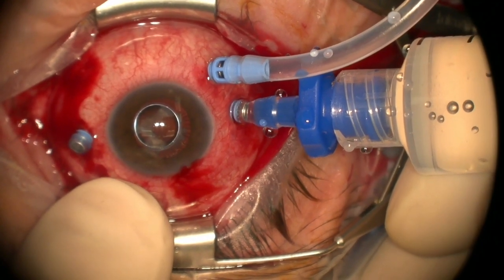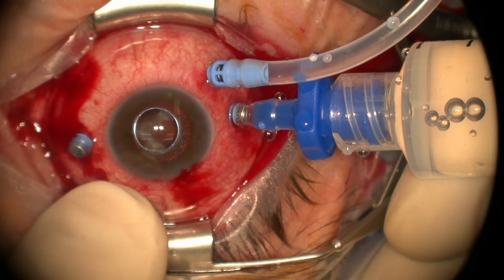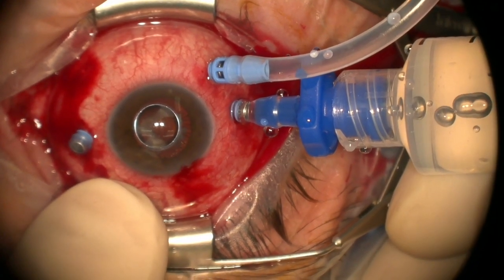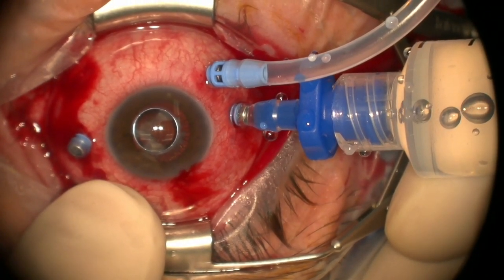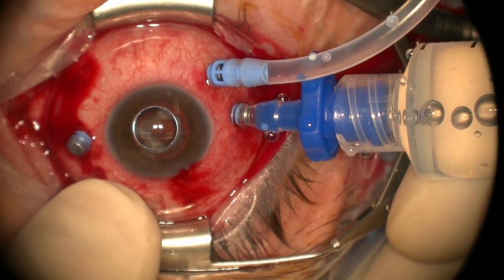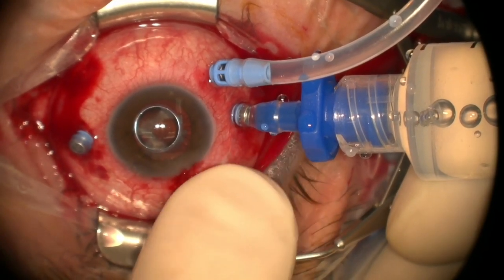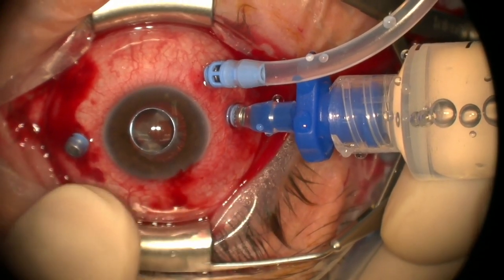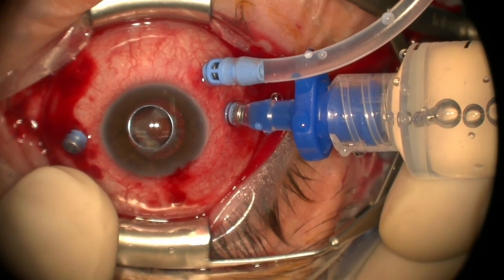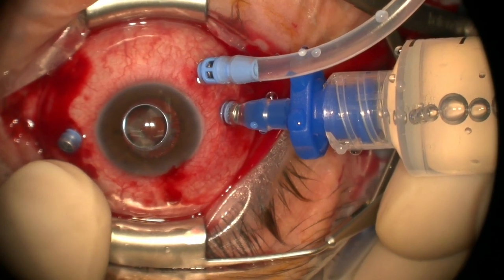So if we made a big wound like that and sewed it shut, it may save us a little time today. But then if something happened and we had to come back, about one more clock hour or half clock hour of the sclerotomy incision areas we can't use. I can't use these up here. I can see the blue areas in the sclera a little bit. That make me very hesitant to want to put any wounds there and have wound leaks postoperatively.